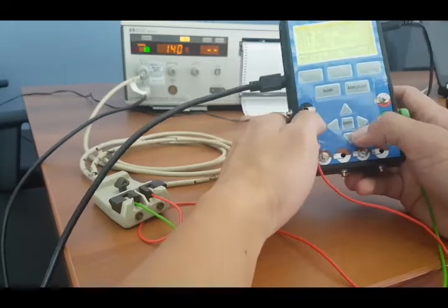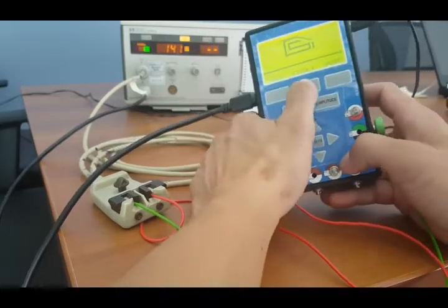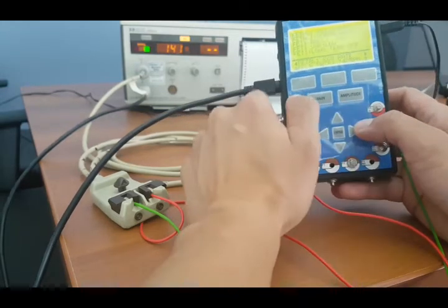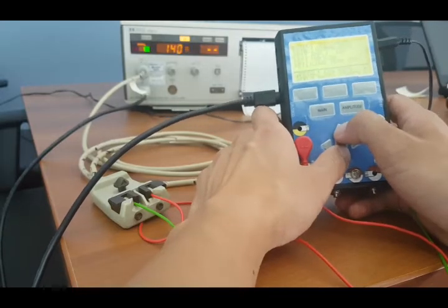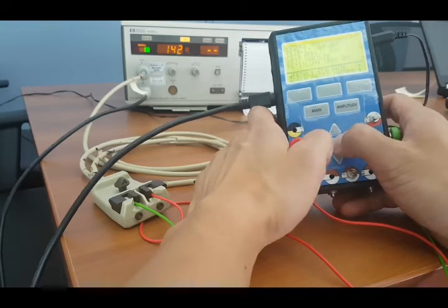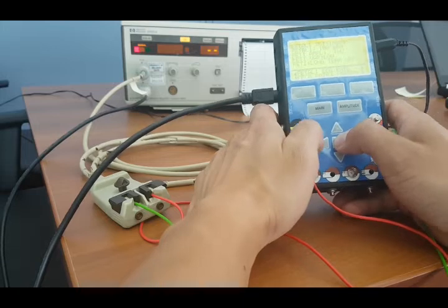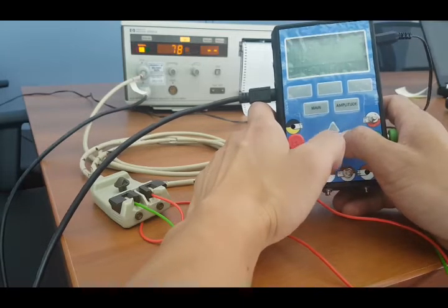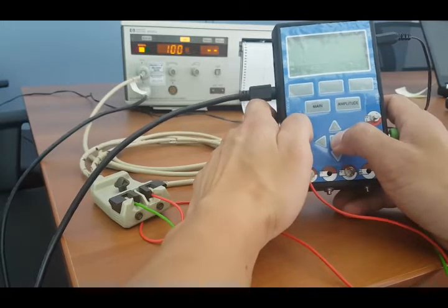Select fetal 1, and you can see already the monitor is reading 140 beats per minute. You can also see here on my display, I'm showing 140 beats per minute as well. So I have a number of different rates available. If I were to change this now to, say, 100 beats per minute, the monitor will now show, let's give it a second. It is an older monitor. 100 beats per minute.